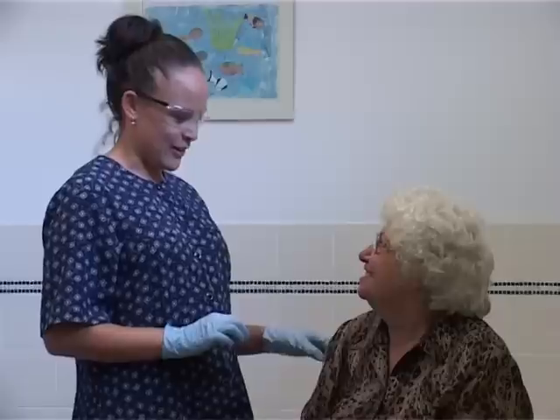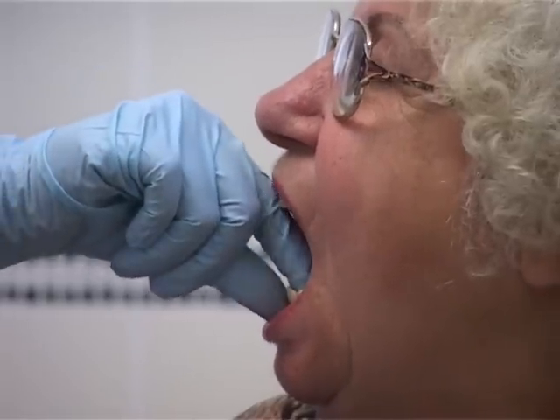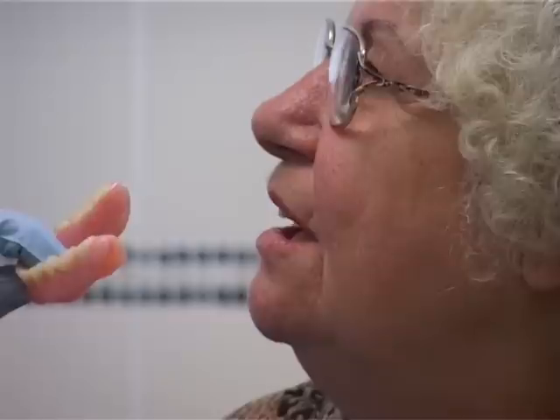Removing dentures can be difficult. The lower full dentures are the easiest to remove, so take out the lower denture first by holding the lower front teeth with your thumb and index finger.